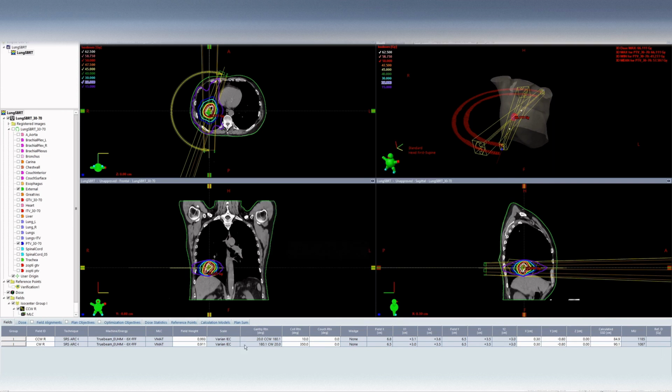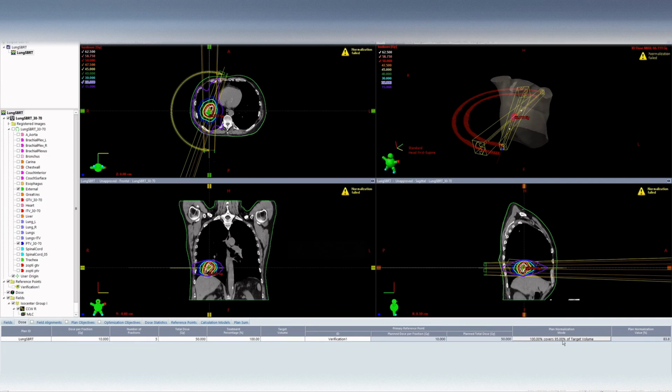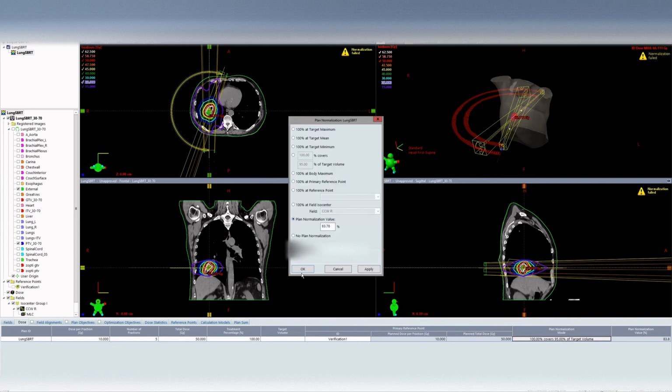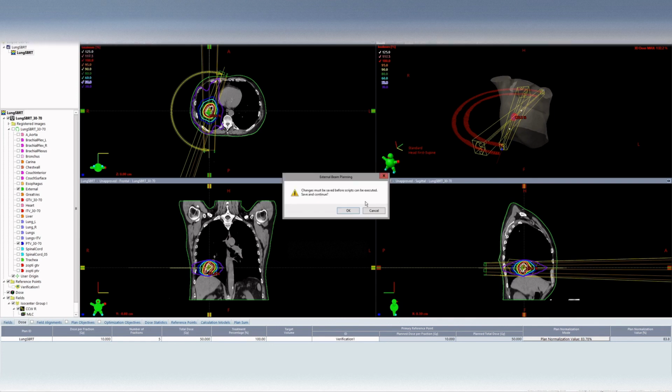So let's test it. If we go to plan properties, we can actually remove the target that's selected by just selecting nothing. So now it didn't know how to normalize, because it was normalized to the volume, and we won't get into that. But yeah, now let's run it and see if it, whoa, that's the wrong thing. And let's see if it will crash.